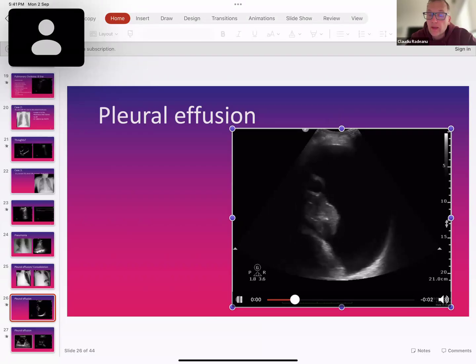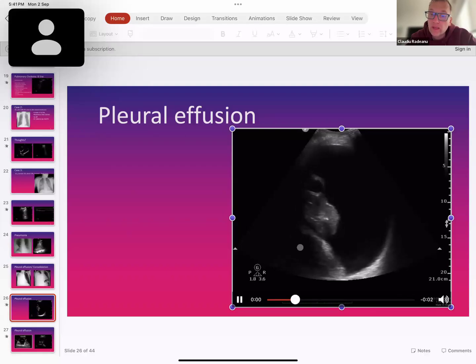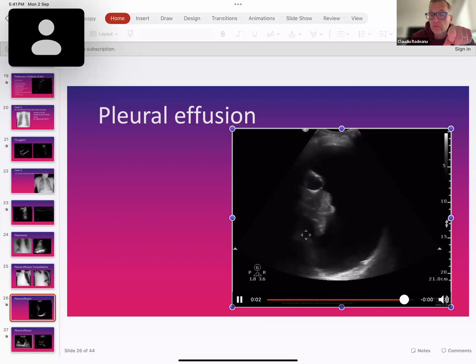Coming back, this is collapsed lung, so that's where I started seeing it. This is atelectatic lung that has been compressed, and therefore all the air has been squashed out, and therefore it becomes this way. All right, so you start seeing it. And this is large. So you would drain, this is a very good spot to drain a pleural effusion.